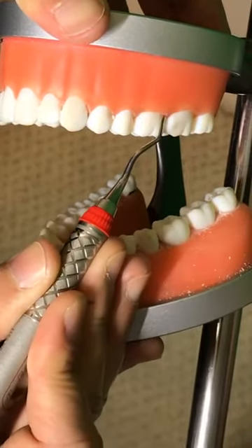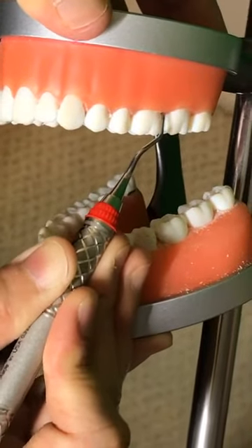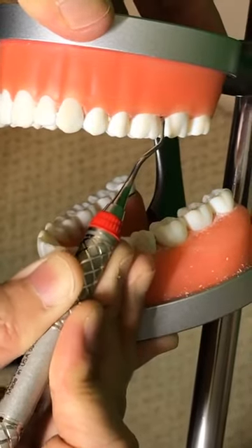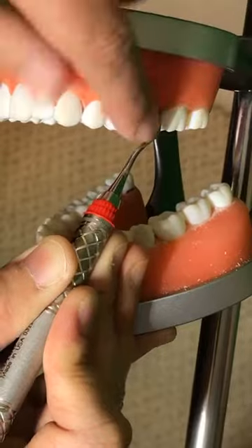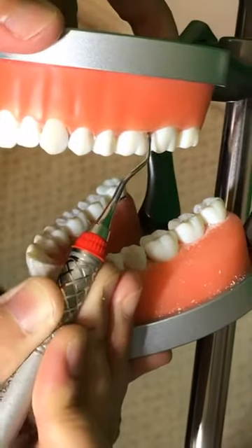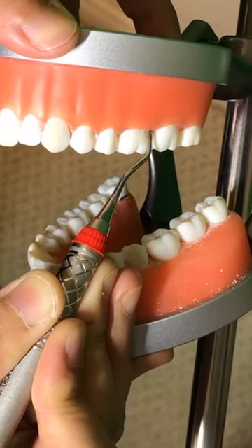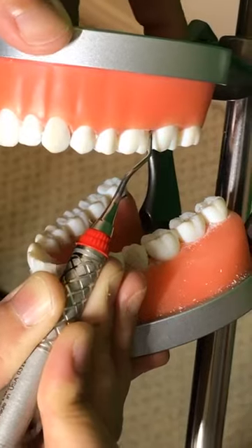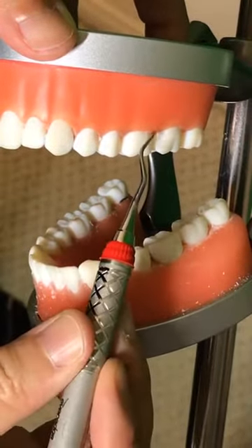If the terminal shank is parallel to the surface, then you feel this cutting edge is going to engage into this tooth surface. So if the terminal shank is parallel to the surface you're working on, it's automatically creating that 70-degree angle because it's already slanted. Let's say you did not know which end to use and you flipped the other end and used the wrong end.